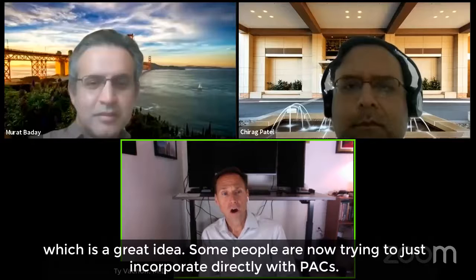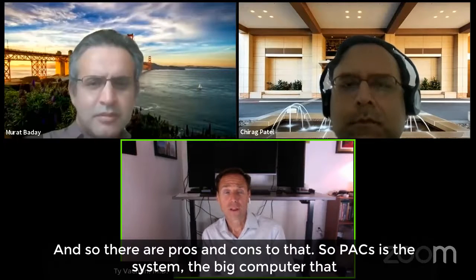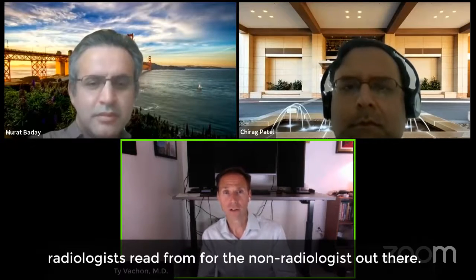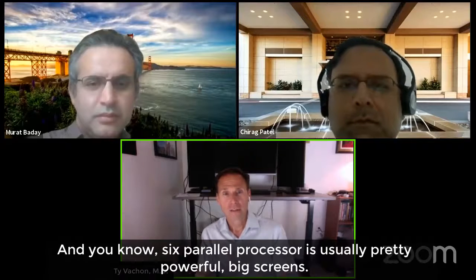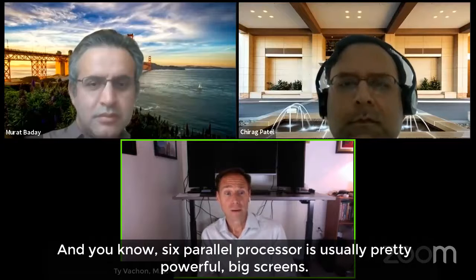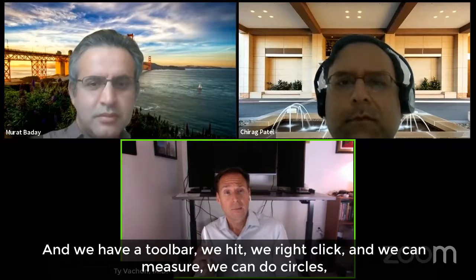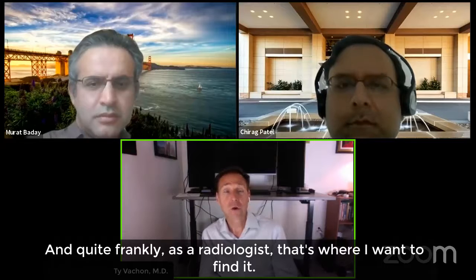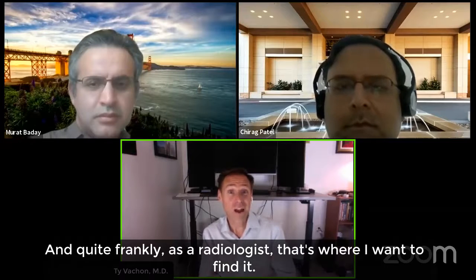Some people are now trying to just incorporate directly with PACS. And so there are pros and cons to that. So PACS is the system, the big computer that radiologists read from, for the non-radiologists on the call. It has parallel processors, usually pretty powerful, big screens. And we have a toolbar. We right click and we can measure, we can do circles, we can do regions of interest, we can do all kinds of things. And quite frankly, as a radiologist, that's where I want to find it.